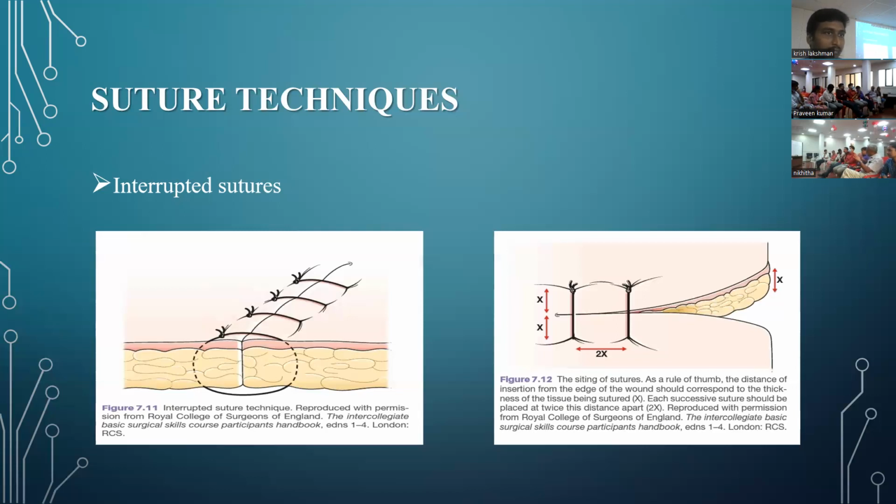You sort of get very casual about it. You don't get tired. Have the habit of doing it at this stage. Learn to do it, because that's the most secure and the best way you can put sutures.